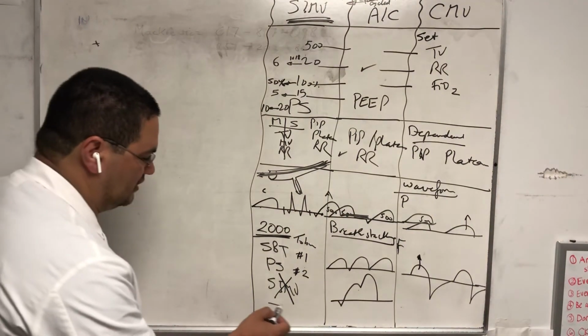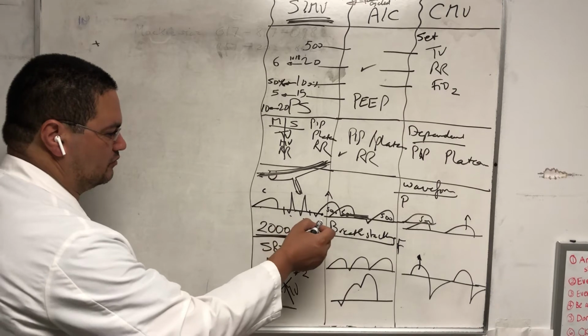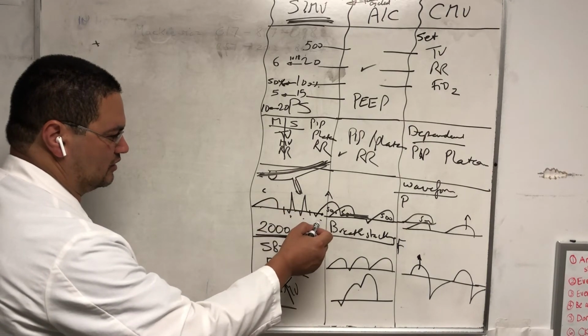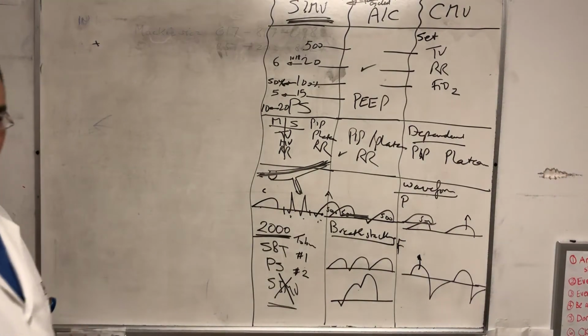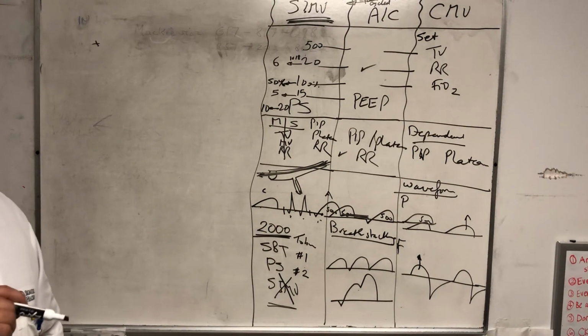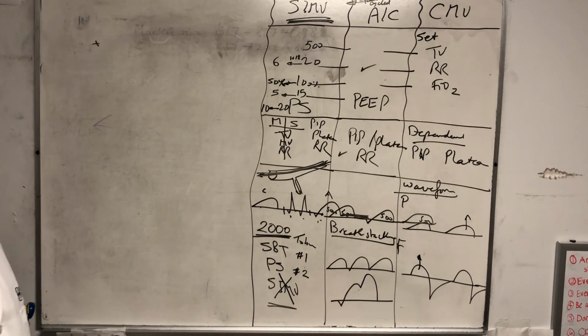But there's one thing that is wrong even with that way of doing it, which is that SIMV confuses the patient a little bit. There are a lot of different breaths. Sometimes I take a breath and get a pressure support breath. Sometimes I take a breath and get a volume controlled breath, and it's all over the place. So the patient requires a little bit more sedation than with volume control. Okay? And that is it.